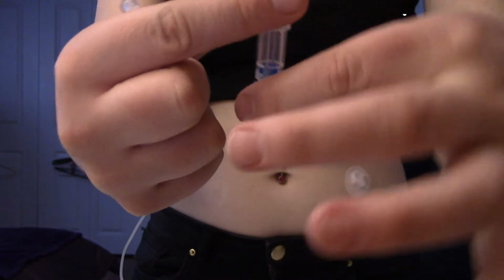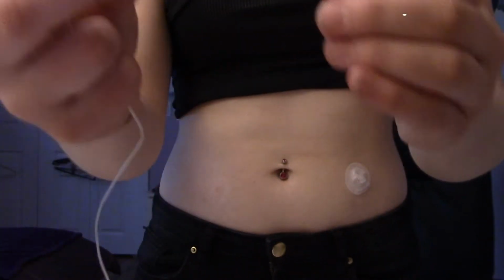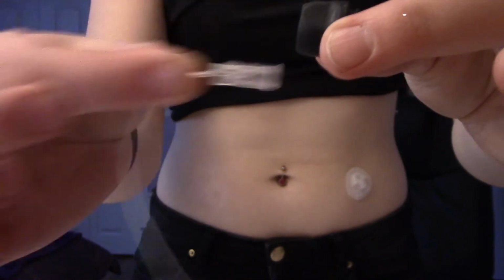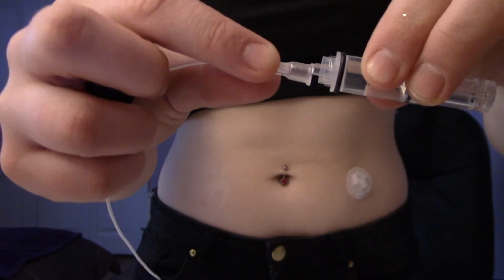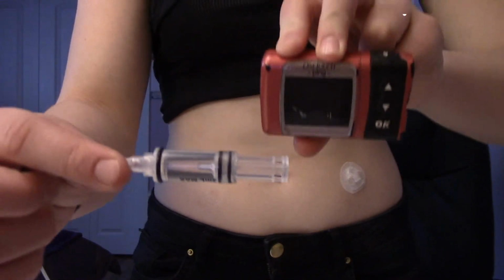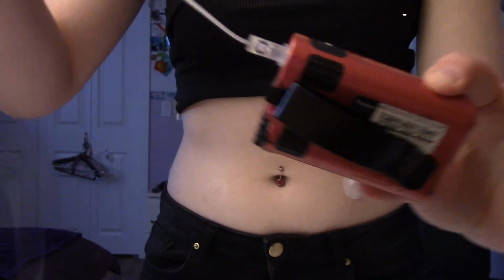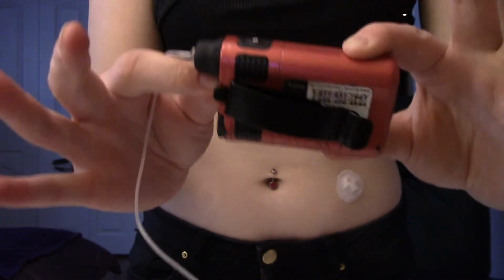And then I'm going to take off the blue part here. You want to make sure you're not pushing or pulling, because it'll push the insulin out. Take my black tip, to set them up, and I'm going to weave this part through the front part of my black tip. Going to go through, and then I'm going to hook this on to my cartridge. All right, next thing I'm going to do is grab my insulin pump, just turn it around for the sake of this. I'm going to be putting it into the cartridge part. Just like that. Weave that black part back. Turn it. Ta-da! It's on.